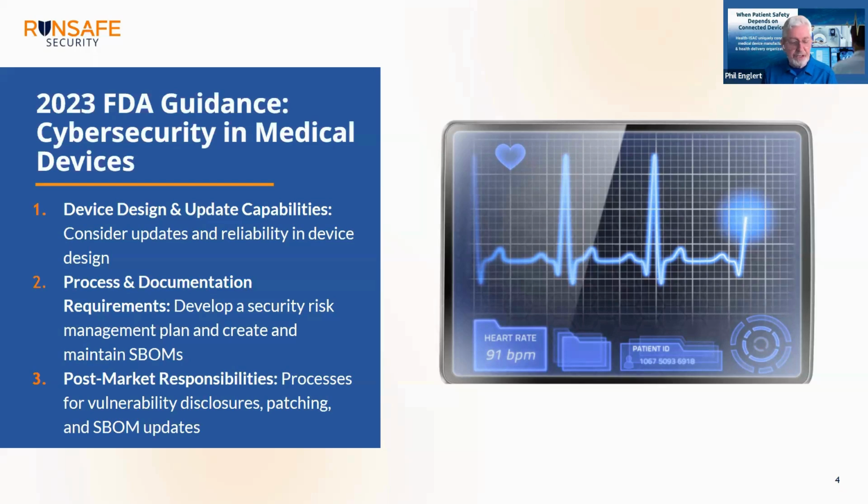And that's certainly a challenge there. And speaking of challenges, let's think about the class 2, class 3 medical devices. Maybe some of them are embedded systems, so what are some of the challenges and those operational impacts that they can have on patient care and healthcare operations?